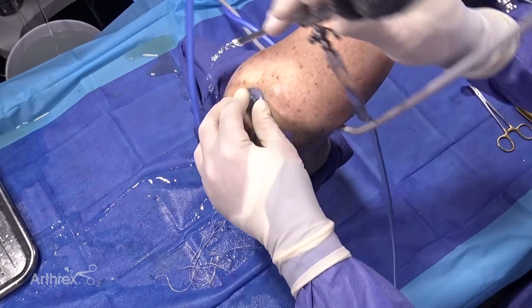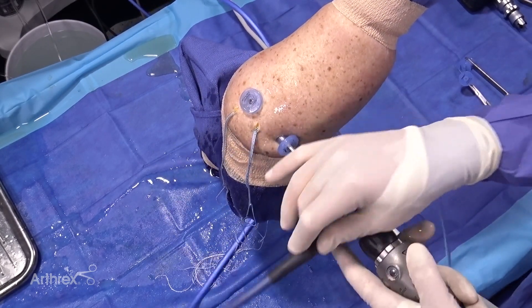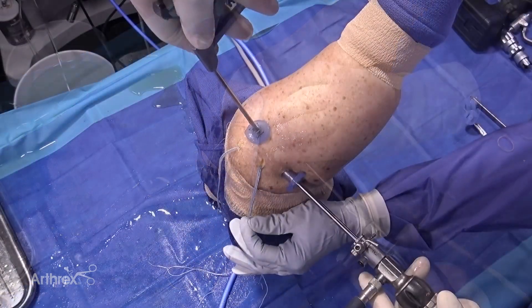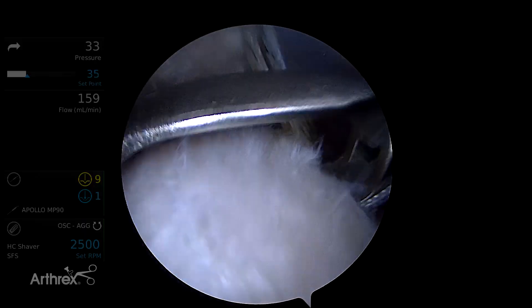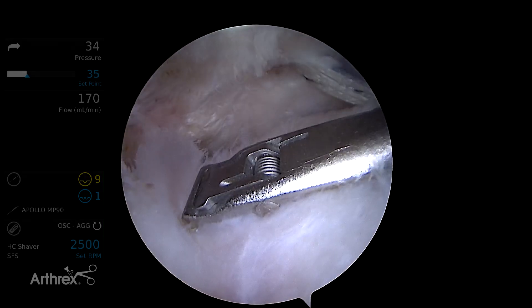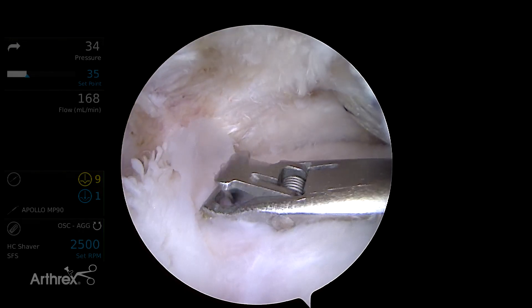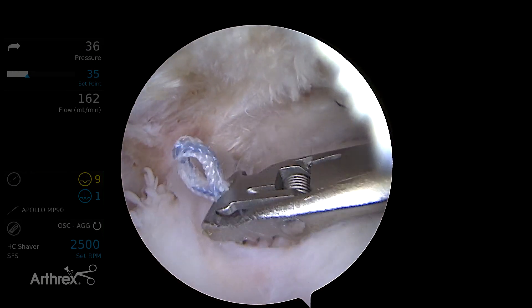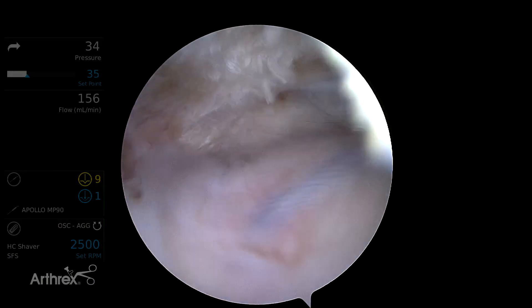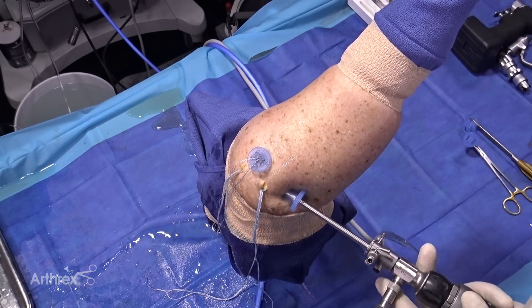Next I'm going to go back to the posterior viewing portal. We'll pass our sutures with the shuttling technique using a suture tape fiber link, and we'll do this with the more anterior sutures first. You want to be about two to three millimeters lateral to the muscle-tendon junction — that's the anatomic point of the tendon that will line up with the articular margin in the non-torn rotator cuff, so that's where we'd want to have it in the torn rotator cuff.